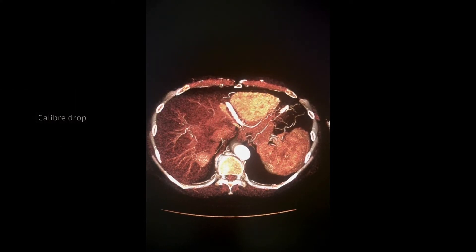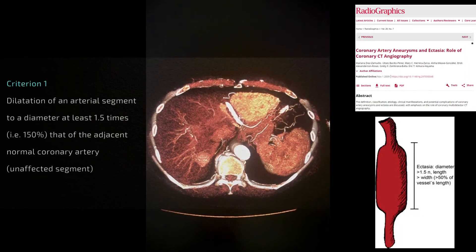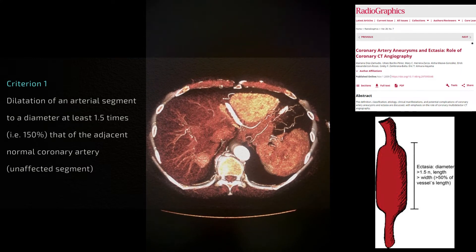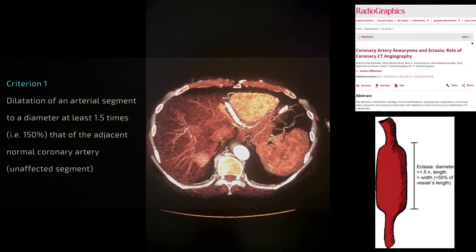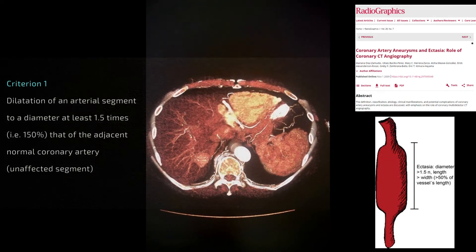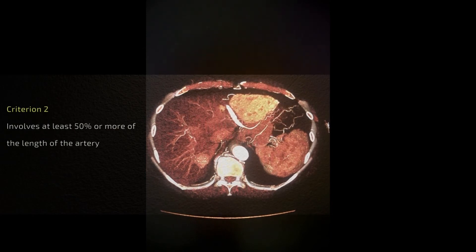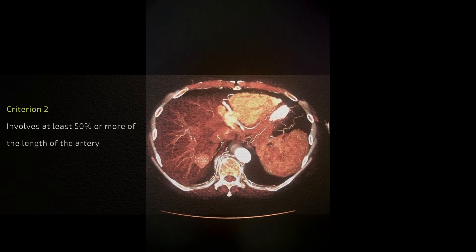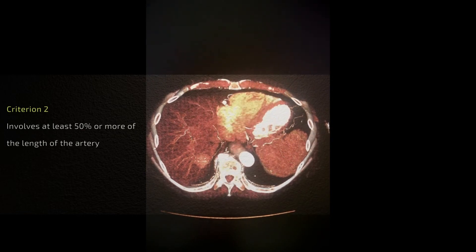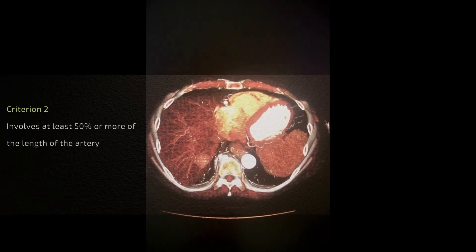According to the usually accepted definition, a caliber change of more than 150 percent, or 1.5 times the adjacent caliber, is sufficient to classify as ectasia, as opposed to a focal aneurysm or other form. This segment should involve at least 50 percent or more of the length of the coronary artery.